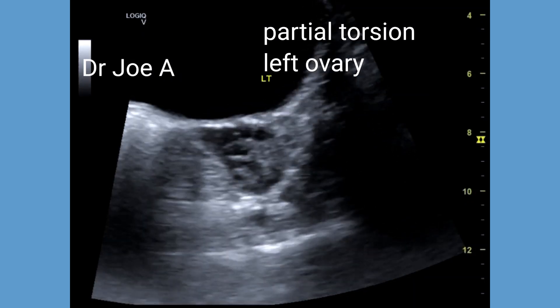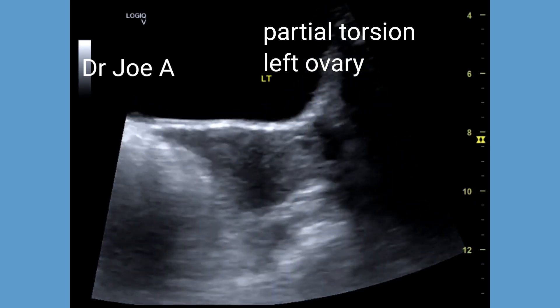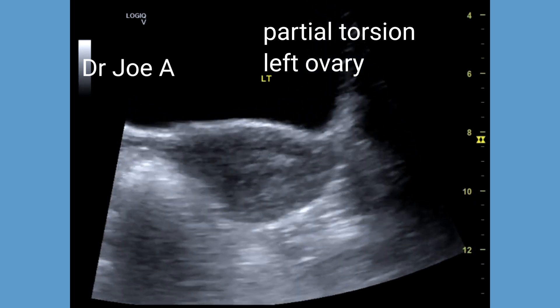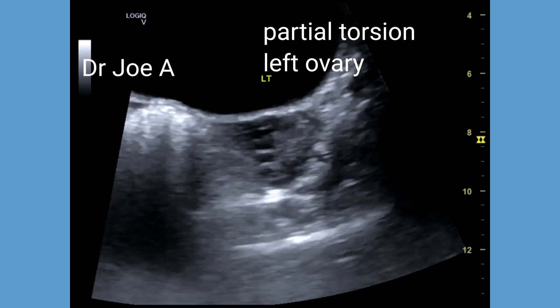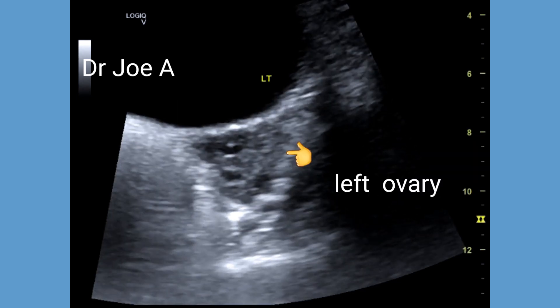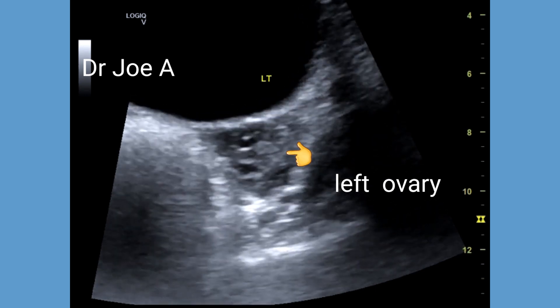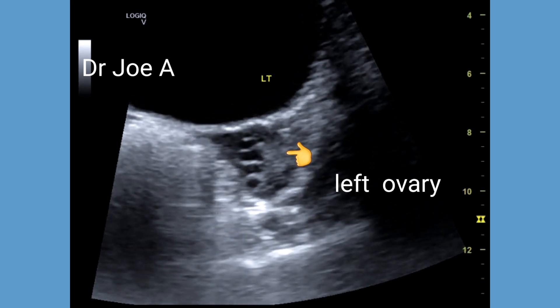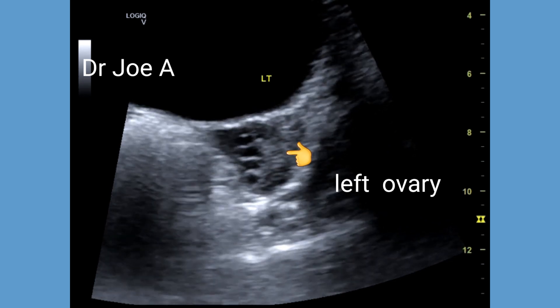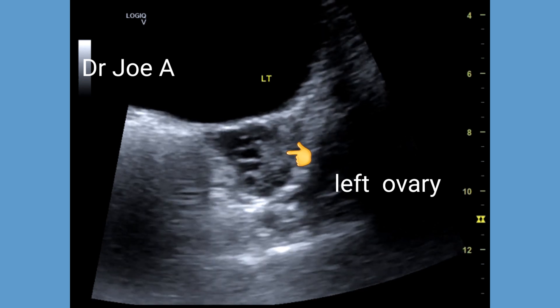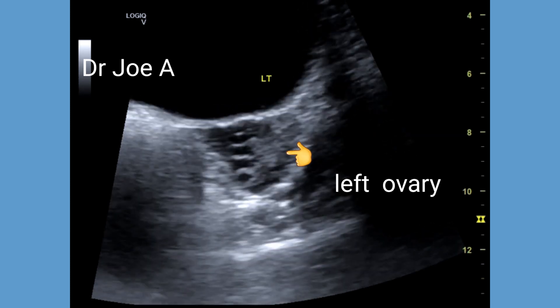This patient with left pelvic pain has partial torsion of the left ovary. The left ovary appears grossly enlarged with a volume of almost 17 cc. Transabdominal ultrasound shows the left ovary positioned superior and anterior to the uterus — a typical sign of left ovarian torsion. Note also the presence of multiple small follicles along the periphery of the left ovary.